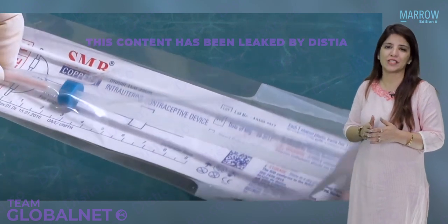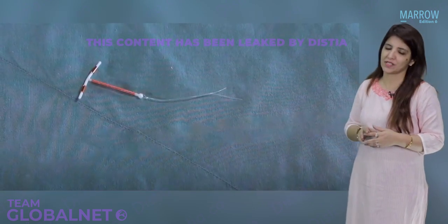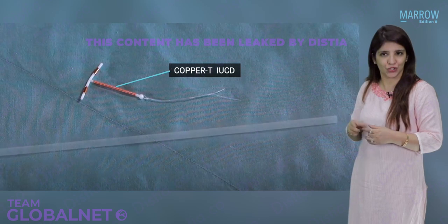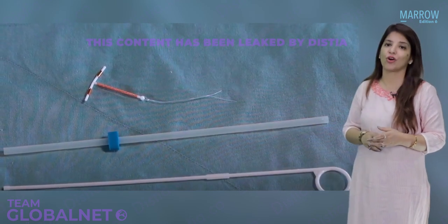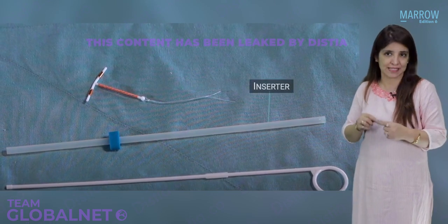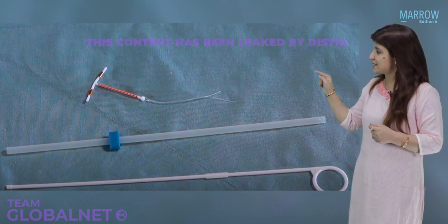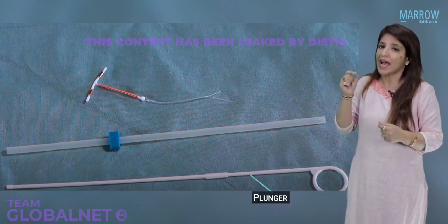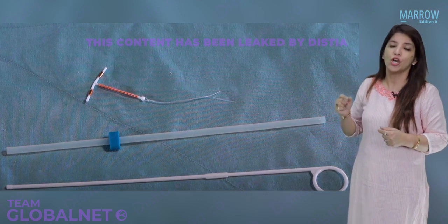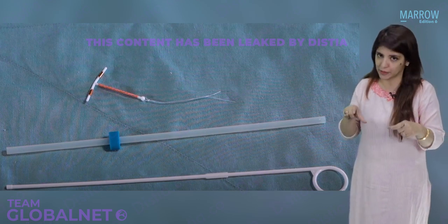For loading of copper T, first you have to understand what is present in the packet of copper T. In a package of copper T, three things would be present. Number one, there will be the copper T 380A, as you can see. Number two, you can see a transparent rod. This transparent rod is the inserter which has got this blue colored depth gauge. And then you can see this white colored plastic rod, which is the plunger, and it has got a thumb rest. So all these three things are present in the packet of copper T.